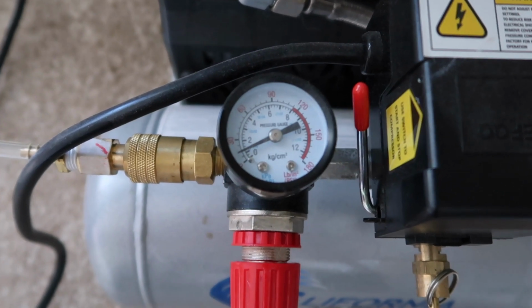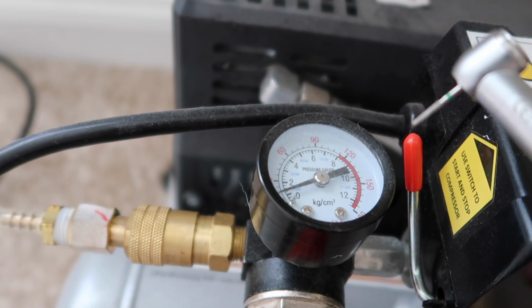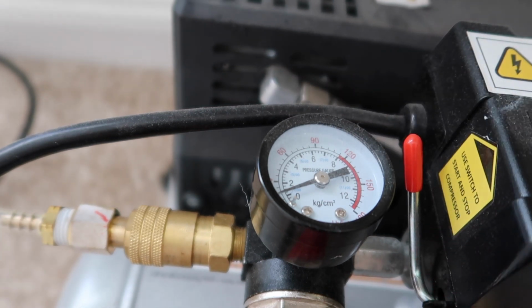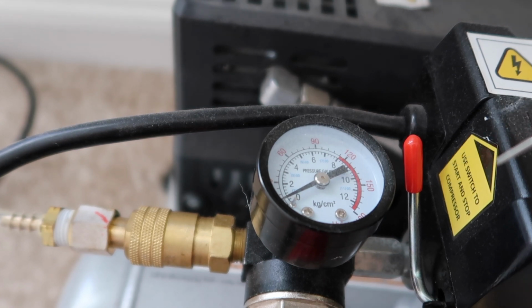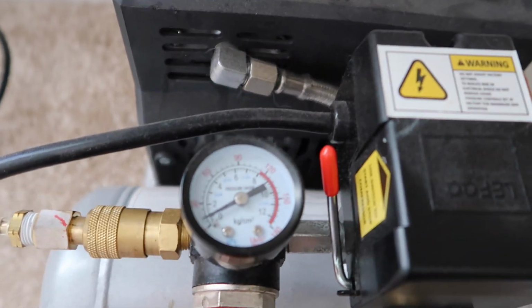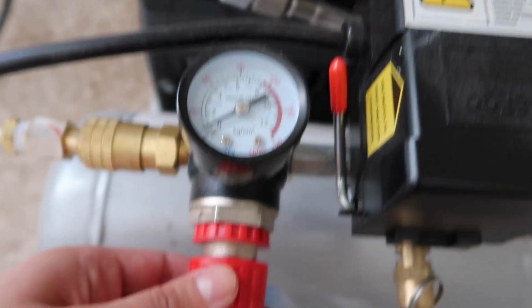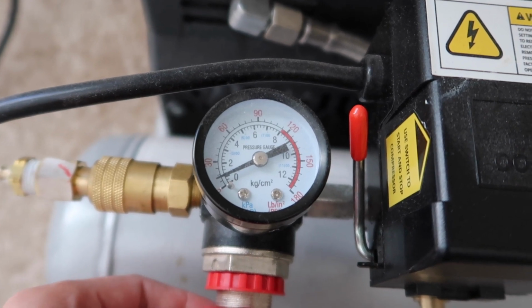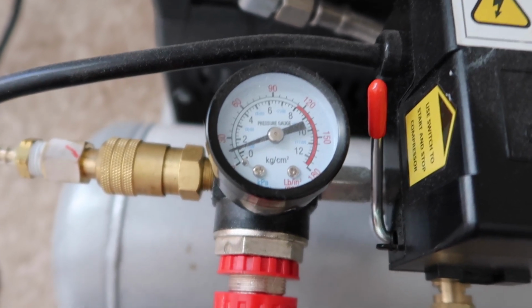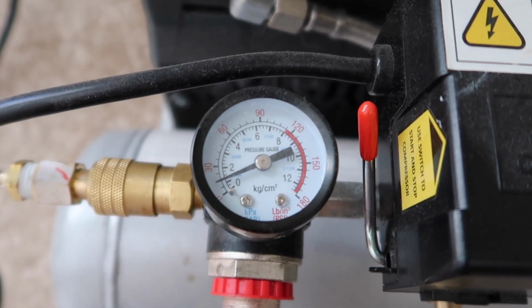See, my pressure over here is really low. Talking about the pressure in the compressor again and stressing how important it is, I have my handpiece in my hand, and I want you to see how low the pressure is in the compressor when I press the pedal. It's very small, so it doesn't go anywhere more than 30. I guess you can increase it or decrease it by using this knob. You can see the little arrow goes up. So now it's up to 30. Alright, I'm ready to prep now.